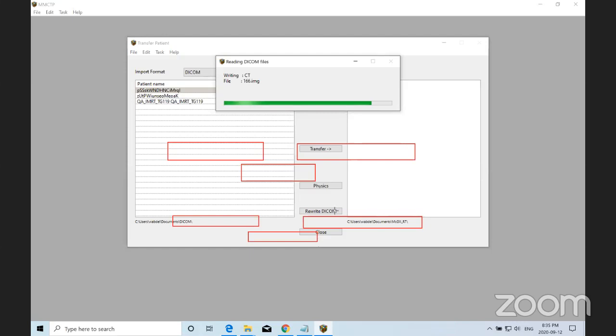But let me tell you again, what's the issue? Let's say at 30 centimeters or so, we have two pairs of jaws. These are X and Y jaws. And then at a different level, we have another two pairs of jaws or trimmers, which we're defining as jaws. Right.